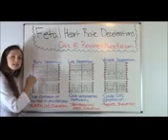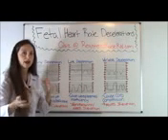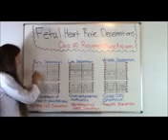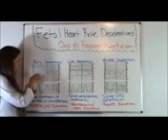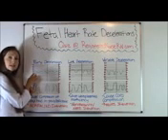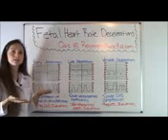And it's at the same exact time that mom's having a contraction. It's mirroring. They're happening together. So we know the reason that baby's heart rate is dipping just a little bit, but it's staying normal. It's staying about the 130s, because 120 is right here. A normal heart rate's 120 to 160, so it's okay that she's just having early decelerations.